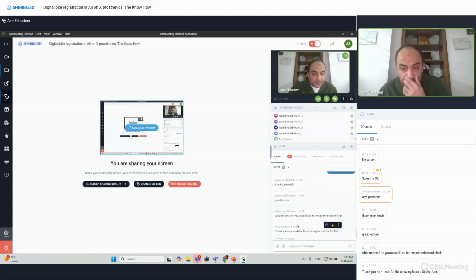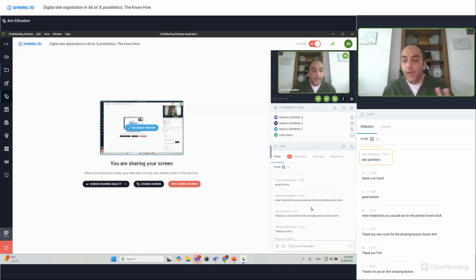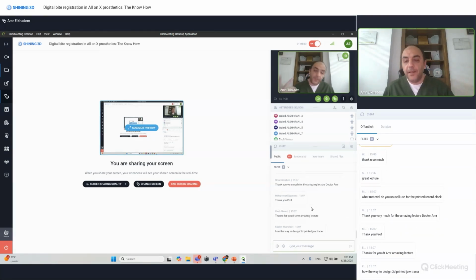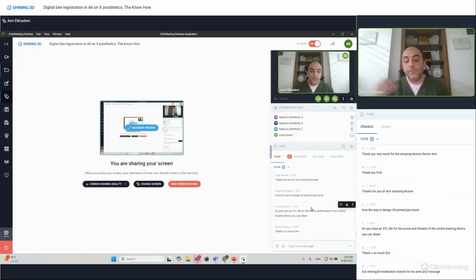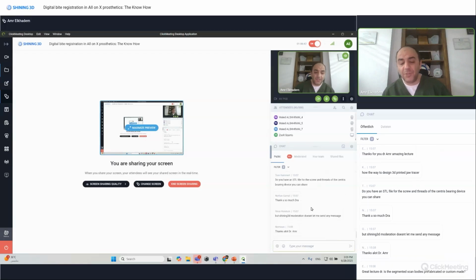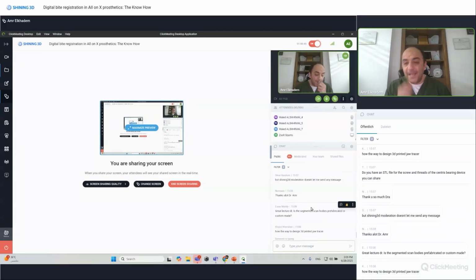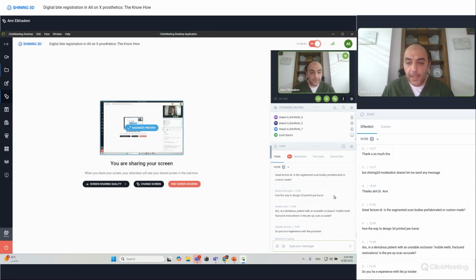Muhammad Bustani is asking, what material do we use for printed record blocks? You have two choices, actually three choices. The first choice is to choose the tray material supplied by any manufacturer, or you can use the model material, just cure it properly, any model material. And of course, you can use the denture material, but it's a little bit expensive for this use. So probably I would use the tray materials.